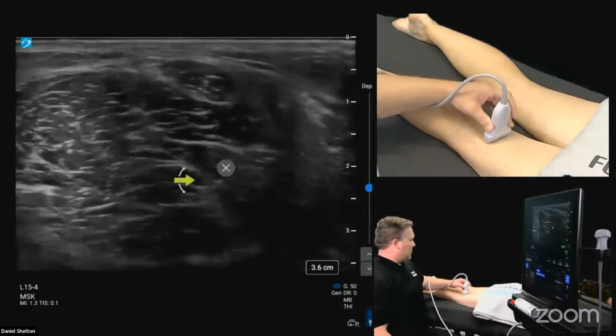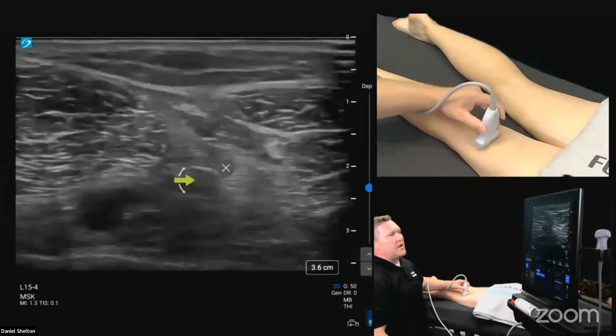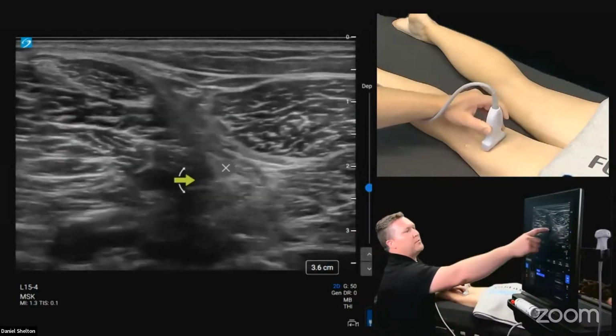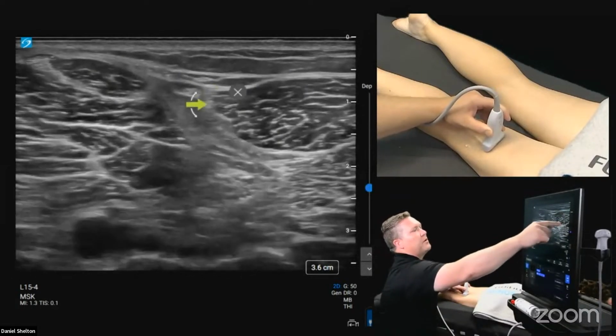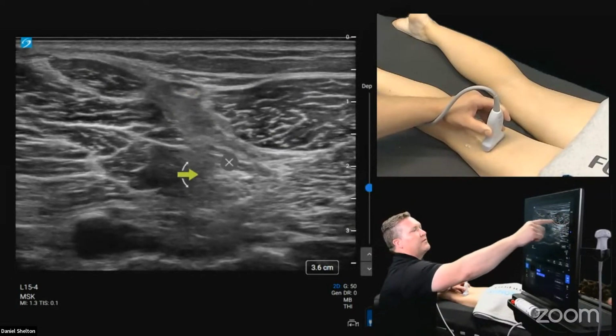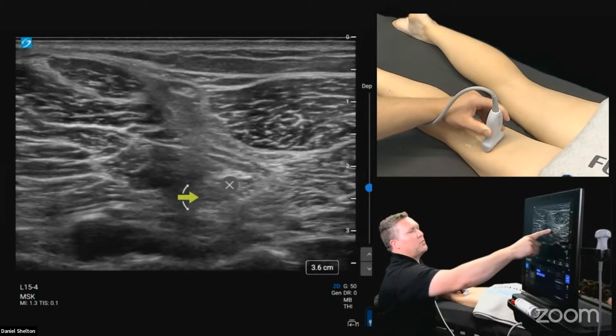So just keep an eye on this: if you're perfectly axial, you may be casting edge artifacts from the overlying muscle bellies here. Semitendinosus up here is what we saw. Biceps femoris up here, and then the septum between the two is casting that big shadow into your neurovascular structures. But we're watching this guy here.